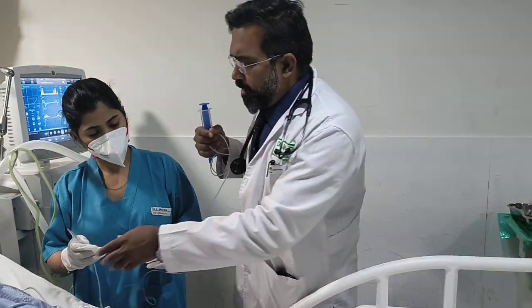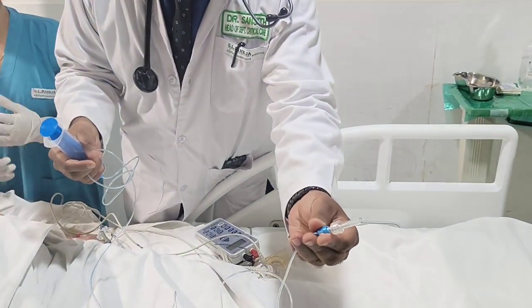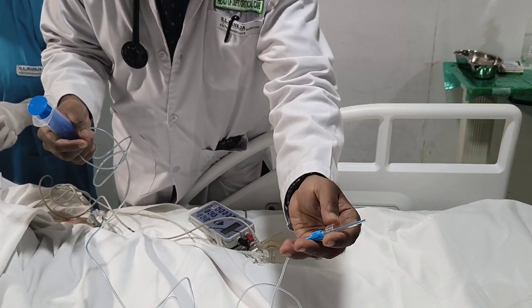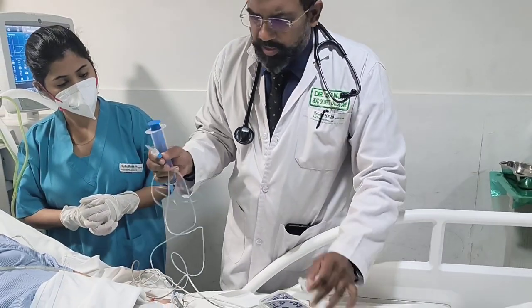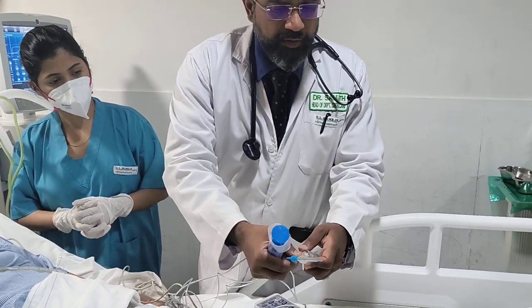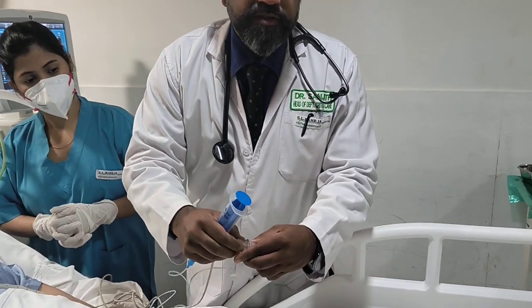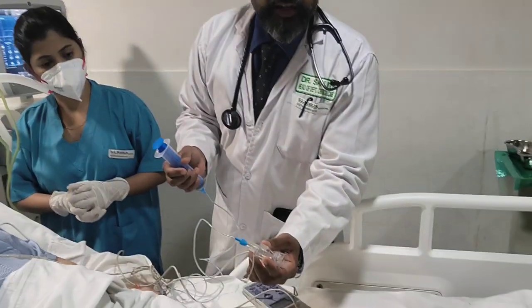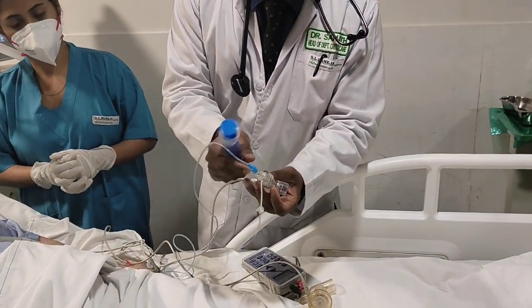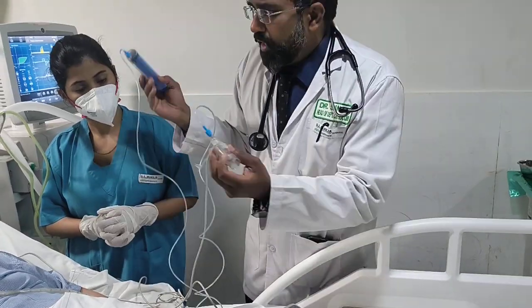What happens with this is the end of the syringe has an attachment that looks like this, which has an end and this kind of tube over here. We take this tube, open this nipple, put this inside and tighten it. It's a dual lock connection that gets tightened inside, so there is no need to open and put again and again. You fill the syringe with the nebulization.